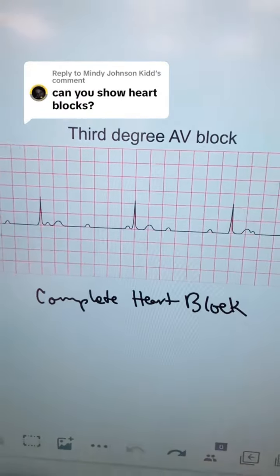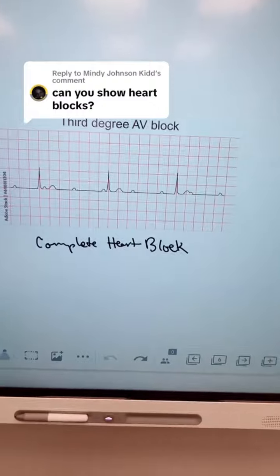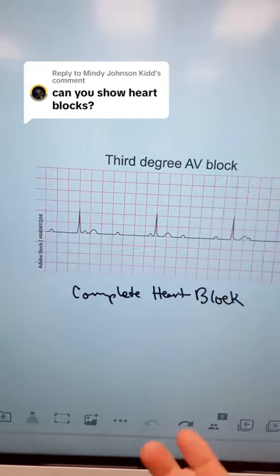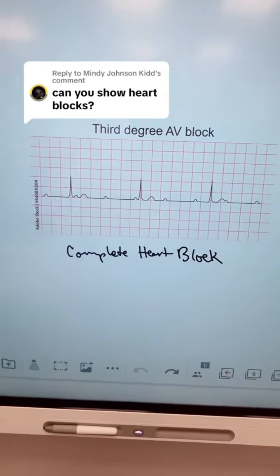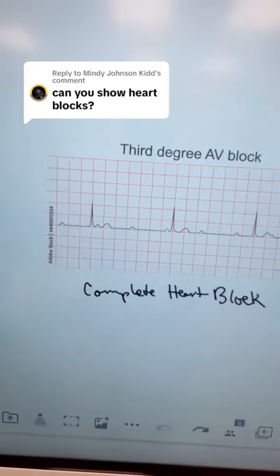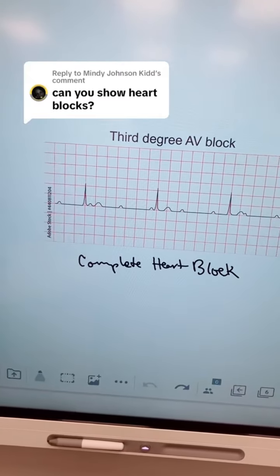They're like a married couple who are still living together, but they're not really communicating. That's what's happening. So the P wave is going and the QRS is going, and what could happen is that you end up having some overlap where the P wave and the QRS, the atrium and the ventricles, are actually beating at the same time, which could easily throw you into one of the deadly rhythms.